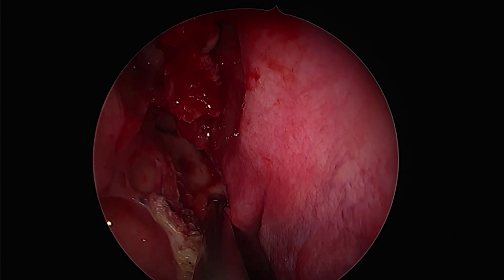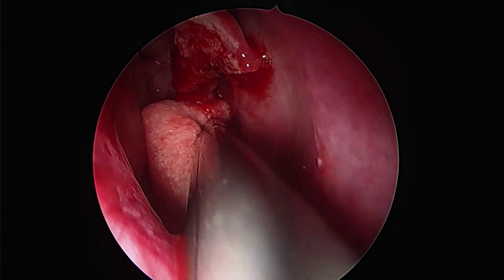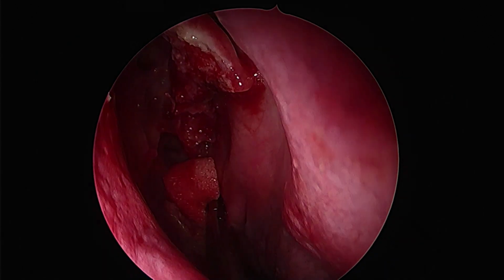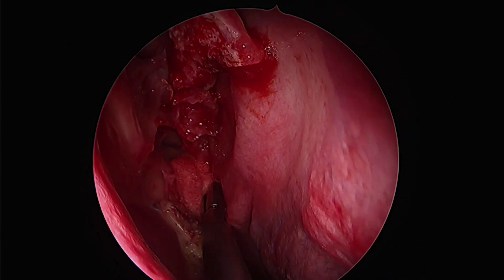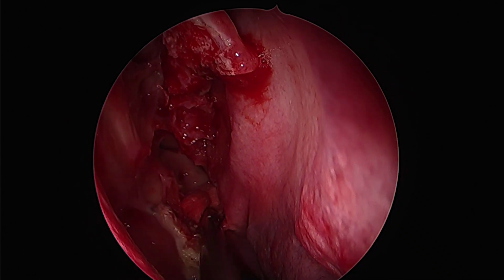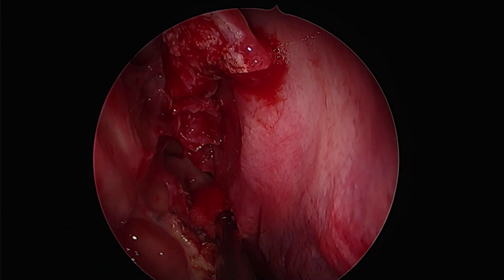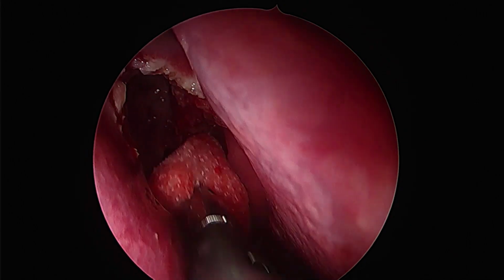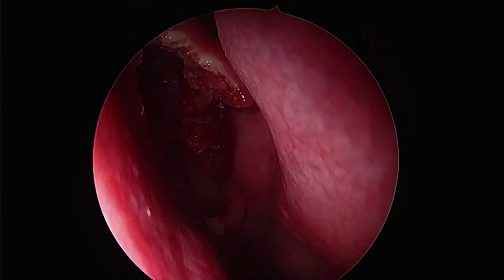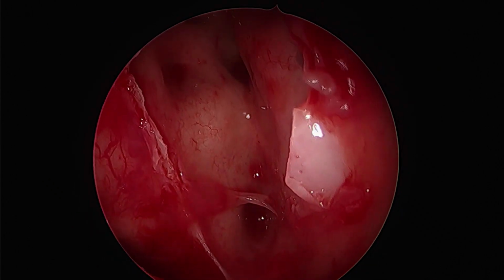In the end, we can even gently mop our cavity with a saline-soaked mucosal patty, just to be 100% sure that we are not leaving any septations or any lesion behind. This kind of cavity now is, I believe, reasonably well amenable to be irrigated thoroughly with either a saline or a steroid infused saline solution on a regular basis. The goal being to avoid oral steroids frequently and to shift to the topical version.